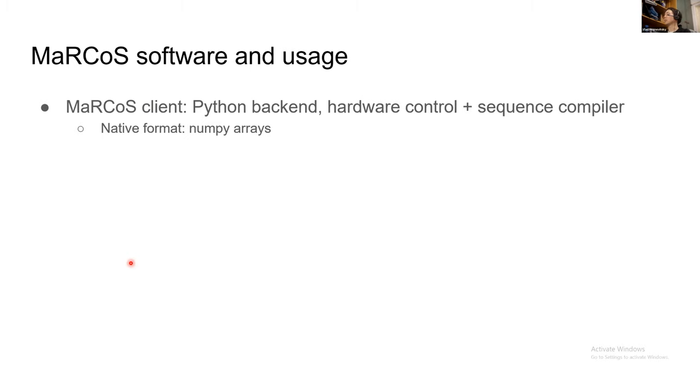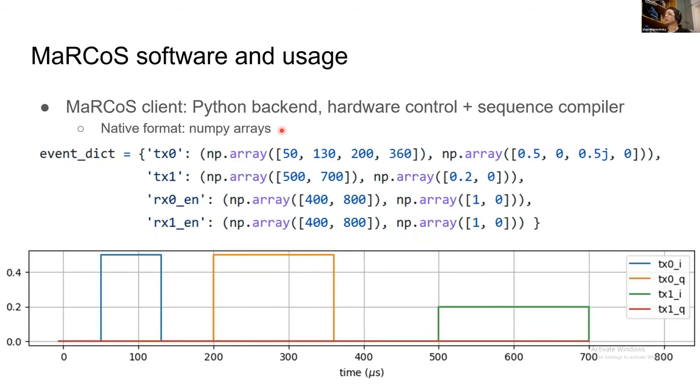The Marcos client runs entirely in Python and handles all hardware control and sequence compilation. Its native format is numpy arrays. For example, you define events at specific times — say 50, 130, 200, and 360 microseconds — with corresponding values for tx0 and tx1 IQ channels. The real and imaginary parts go up or down to specified values at each time point. It's a simple interface and you can do the same for gradients and all other outputs, making it easy to write scripts directly in Python.